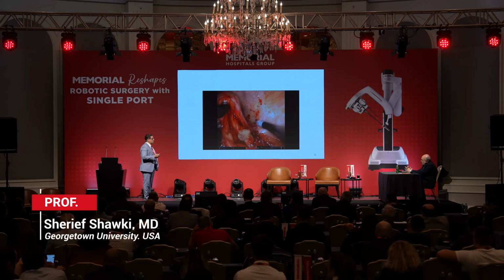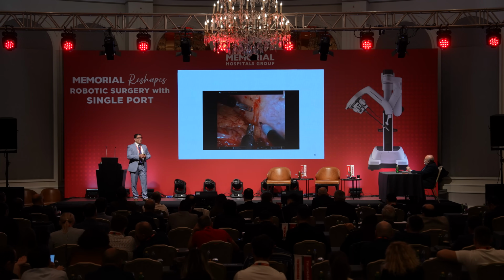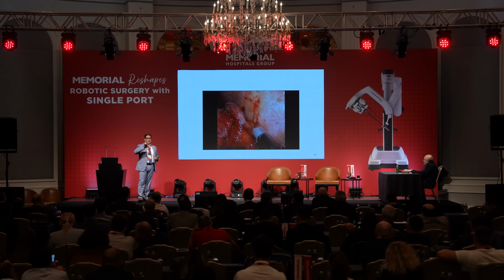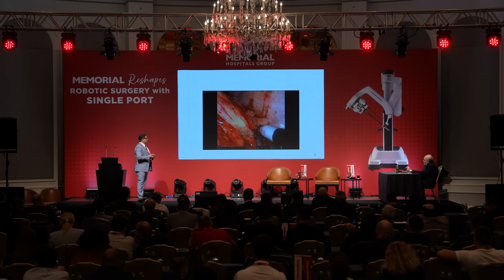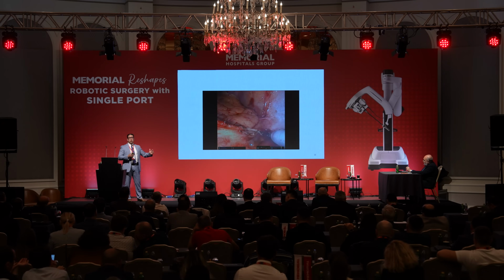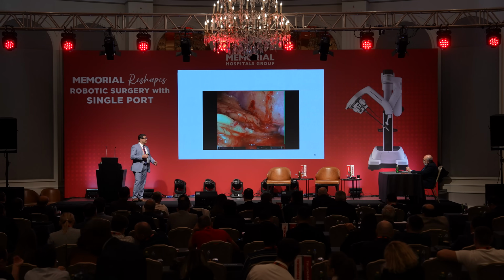Another thing I found is that when I am in the right plane in the transanal approach, the air dissects the colon and makes it easier for me in the transabdominal approach. And you will see how good it is, because I'm going to medialize the colon completely. I'm going to even identify the IMA from the lateral side.